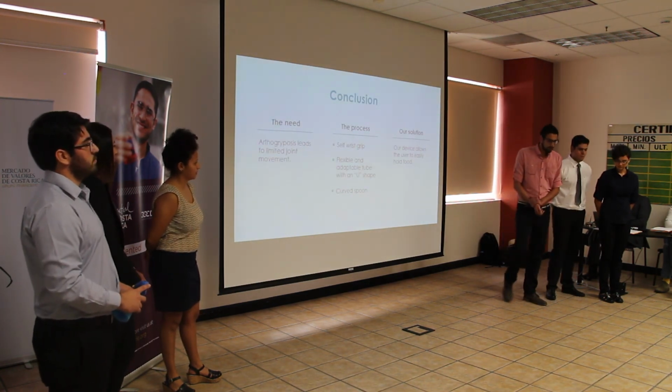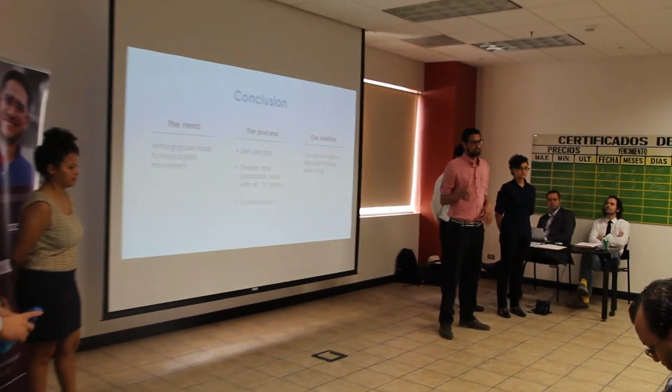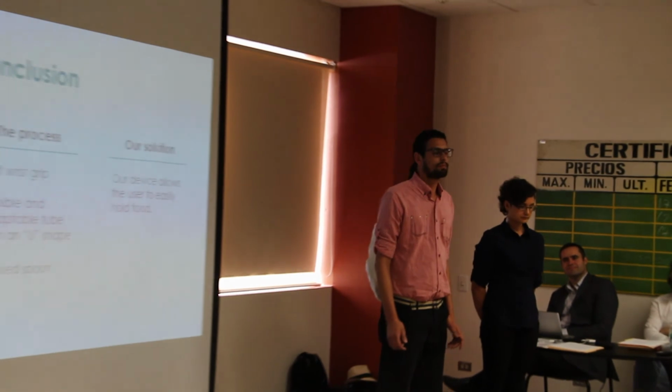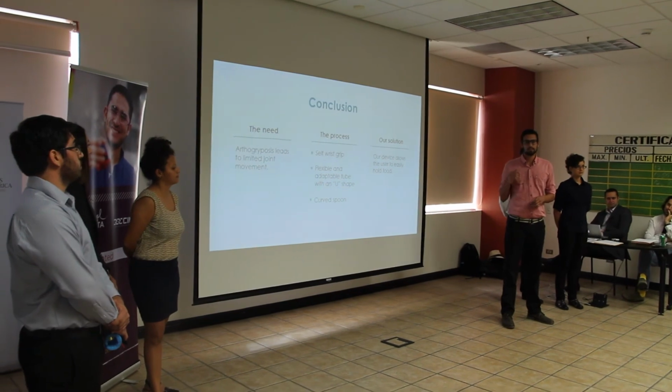Well, as a conclusion, through the development of this device, we saw that the principal need is self-feeding for children from 5 to 12 years old with arthrogryposis, and we faced it based on the engineering design process, focusing on our design criteria such as self-feeding, flexible, and other ones.